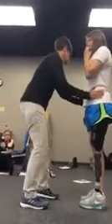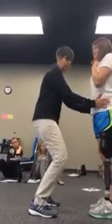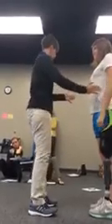This can be kind of hard to do. You want to back up just a little bit so we have a better run. And you guys let me know when I'm going to hit the wall. So I can just put my hands right here. And I can actually already see that my right hand, it's back a little bit. She just tends to hold that back. A lot of people do tend to retract that hip on the prosthetic side, right?